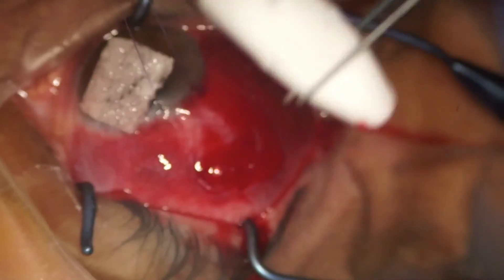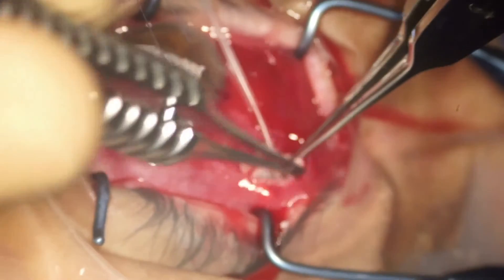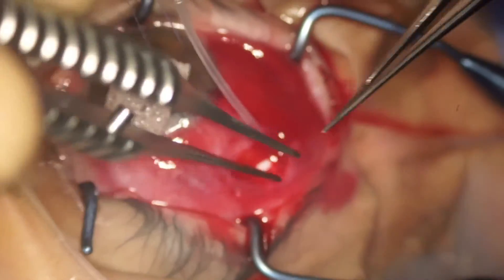What I do is make a small incision, limbus-based peritomy, and insert the rolled or TACO ClearPath 250 into that small incision. It's really quick — it takes about 15 to 20 minutes. This is a great advantage when you combine it with cataract surgery, and I do a lot of these combined procedures. I jokingly say it can be considered a MIGS — of course it's not really a MIGS procedure — but it has all the pros and cons of major glaucoma surgery while fitting into a busy surgical schedule.